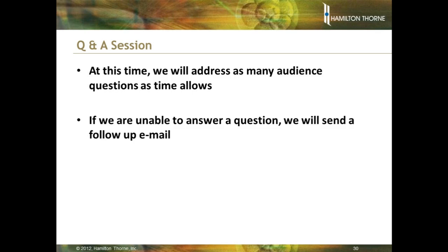There are some questions here that are about specific lasers, so I think maybe we could take some of these offline. Dermot, what is the best power value to use here? I strongly recommend using the power value at 100%.